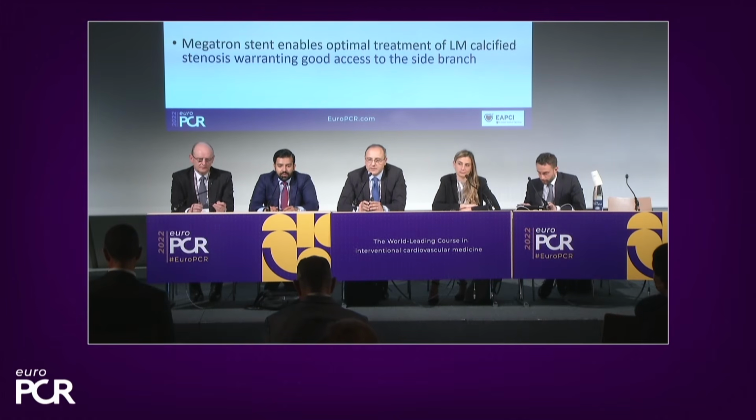Cutting balloon is an effective and safe treatment for superficial non-concentric calcified lesions. We had a beautiful example in this case from London. And finally, Megatron stent enables optimal treatment of left main calcified stenosis, warranting good access to the side branch.